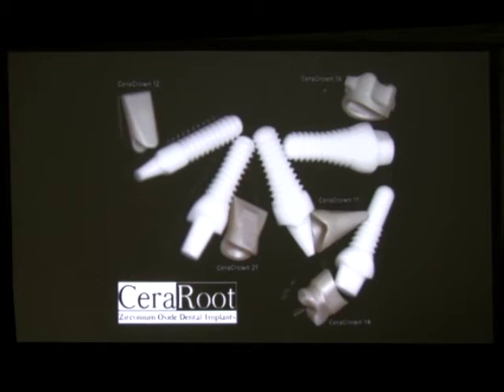They just put it horizontal, so they put the tooth structure horizontal. The plastic is parallel to the floor, so it doesn't keep dropping down. So you put this, you do one layer, you cure, you do another layer, and so on. Enough so that between the veneer and the abutment there is plenty of space.